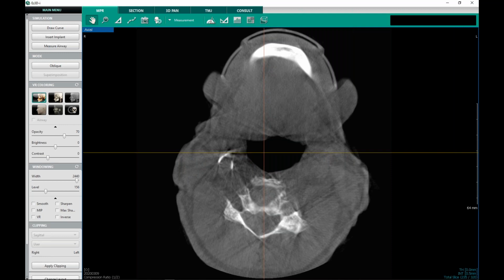You can send them off to their primary care provider for simple serology and a urine test. And you can look in other portions of your cone beam volume, and if you see some other rounded, circular, curvilinear, or parallel line kind of calcification, you probably should be very diligent in pursuing the diagnosis of diabetes.